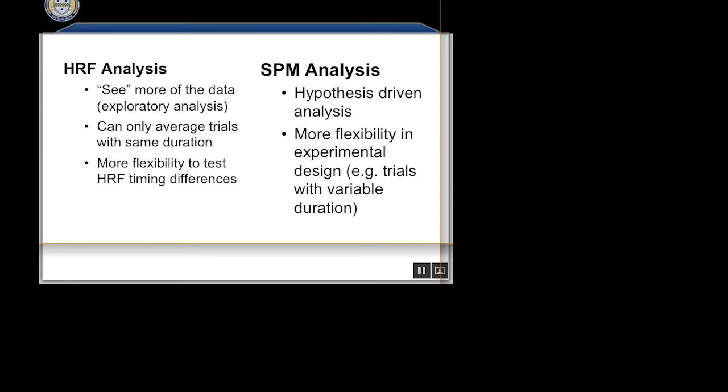It turns out that imaging babies, I don't know what the shape is, really wasn't as big of a deal as we thought it was. I have a new paper that's about to come out that does nonlinear regression and estimates the response, and actually looks at some of these issues. It runs simulations, putting in data with a wonky hemodynamic response that peaks much later than my canonical one, and asks, well, how bad is it if I used the wrong model?